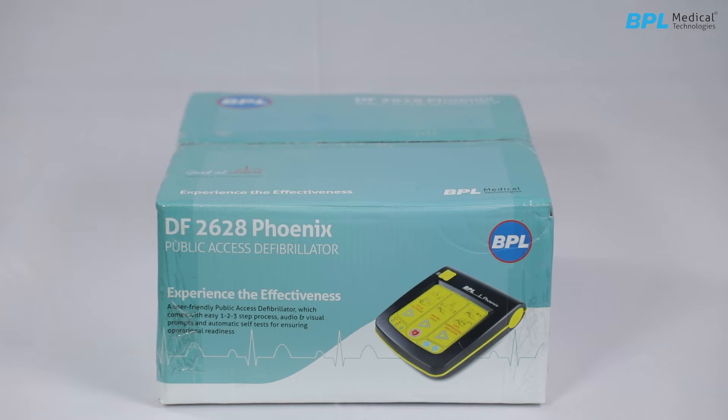Introducing BPL DF 2628 Phoenix. Welcome to the guide for unpacking and operating the BPL DF 2628 Phoenix.